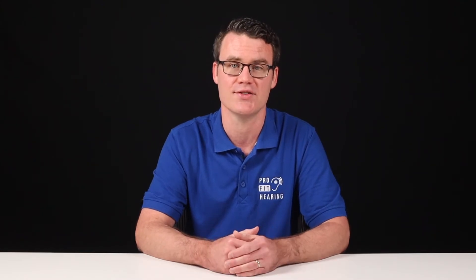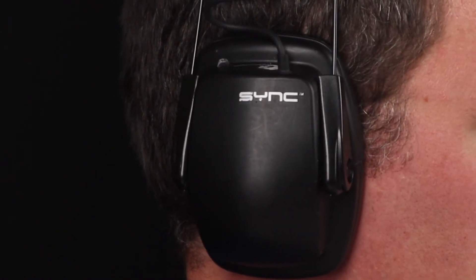Wear hearing protection whenever you are in a loud, noisy environment. Protect your ears from loud sounds so you can help prevent noise-induced hearing loss and tinnitus, or ringing in the ears. You can get even more noise reduction if you also wear earmuffs over the earplugs. You may need to wear both earplugs and earmuffs together depending on how loud the activity is.